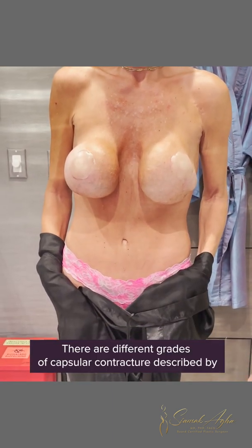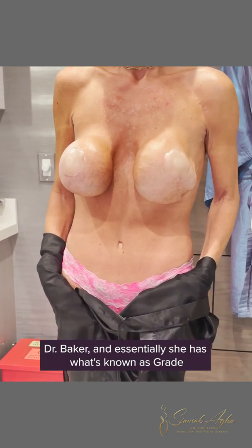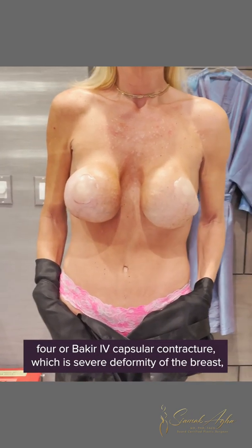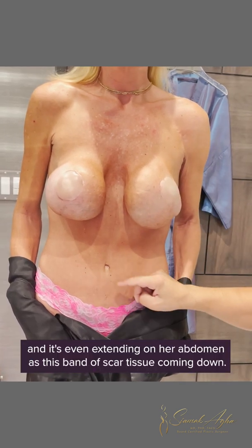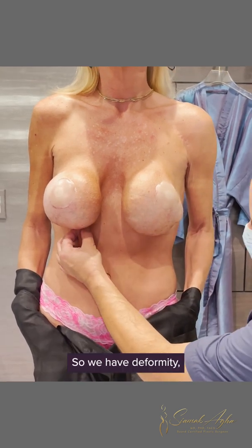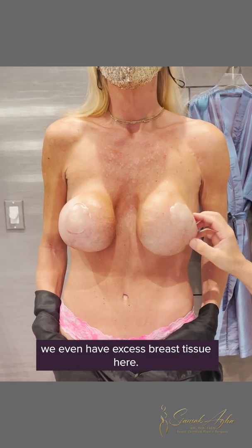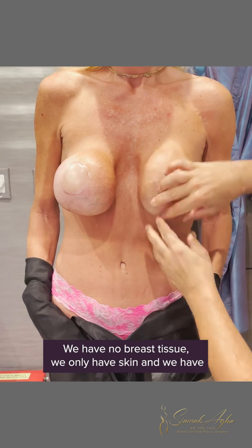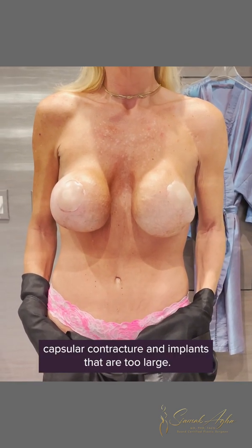There are different grades of capsular contracture described by Dr. Baker. She has what's known as grade four or Baker IV capsular contracture, which is severe deformity of the breast, even extending under her abdomen as this band of scar tissue coming down. So we have deformity, excess breast tissue here, no breast tissue there — only skin — and capsular contracture with implants that are too large.